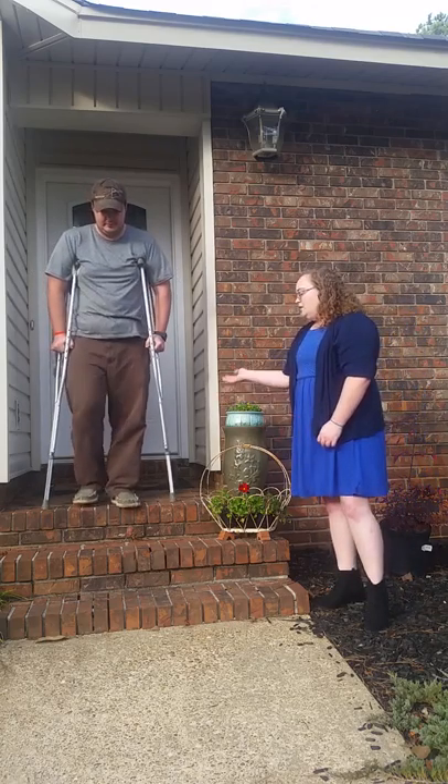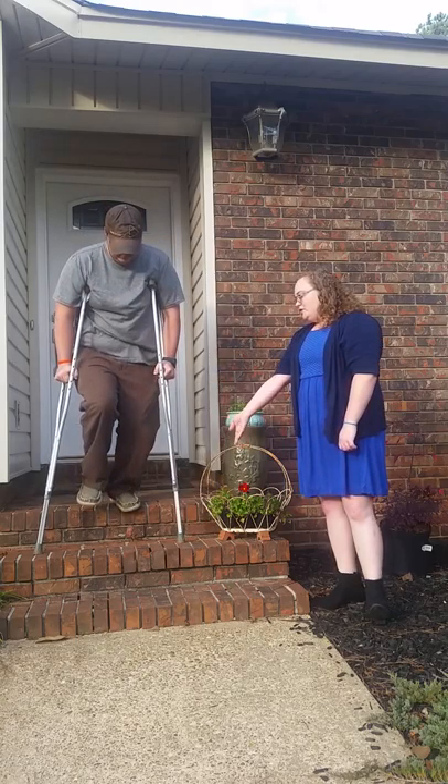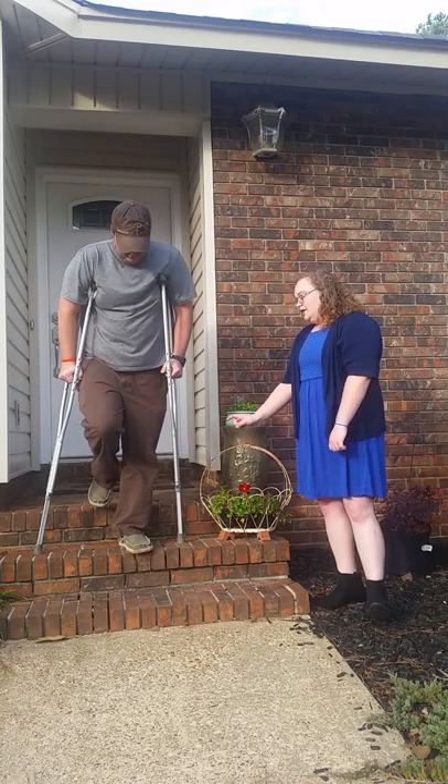Going down steps: take your crutches and your injured foot down to the step below first, then bring yourself down with your uninjured foot and repeat.